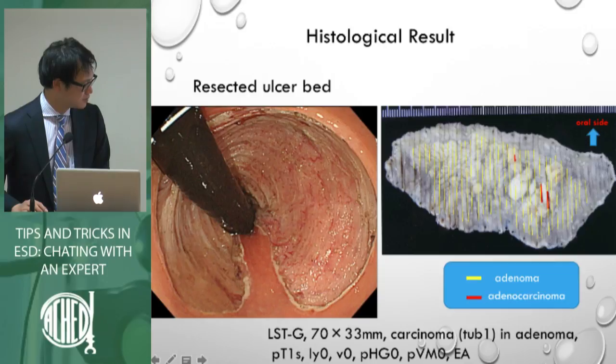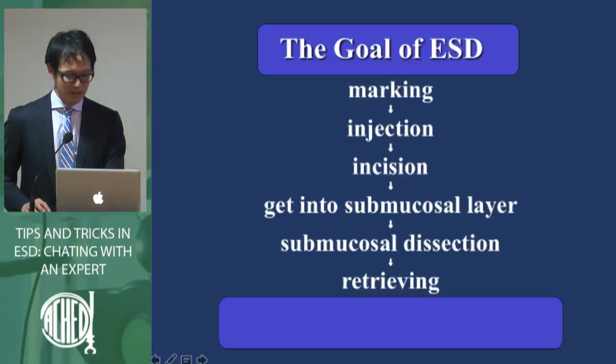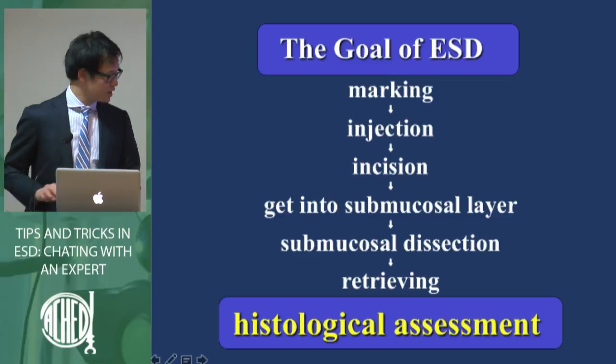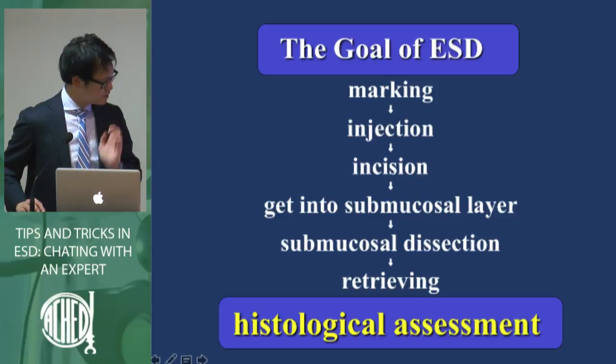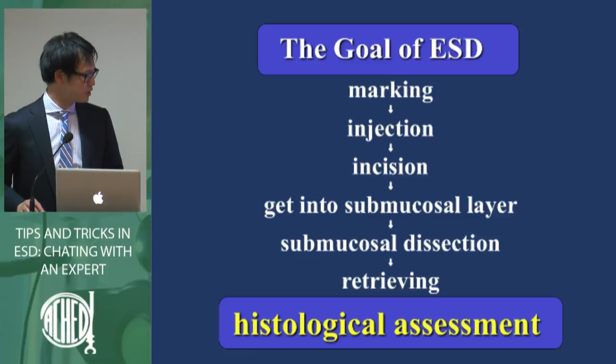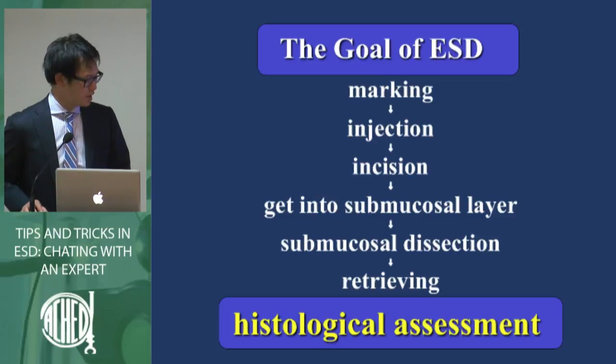So this is 70 millimeters by 33 millimeters. This is a carcinoma in adenoma, and it can be resected completely. So this is the conclusion. The goal of ESD is to resect the tumors, and then finally we have to evaluate the histological assessment. One of ESD's advantages is we can get good quality specimens. If you resect by piecemeal EMR, you cannot do histological evaluation.